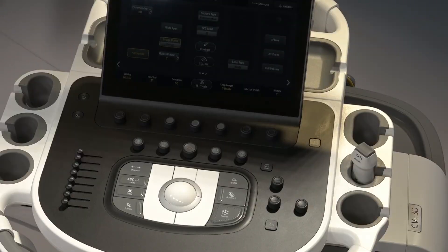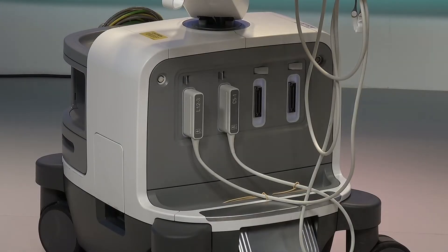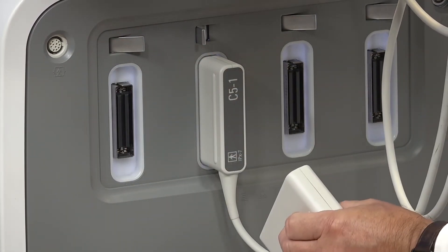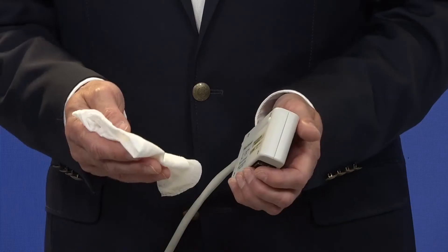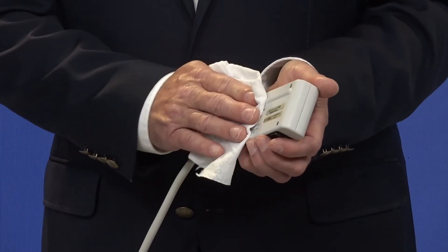If you want to disinfect the connector housing, first press freeze on the control panel and disconnect the transducer from the system. Spray some fluid on a soft cloth or take the wipe out of the container and clean the outer surface of the connector. Do not use paper or other material with a rough surface like an abrasive sponge in combination with the spray to disinfect the connector.